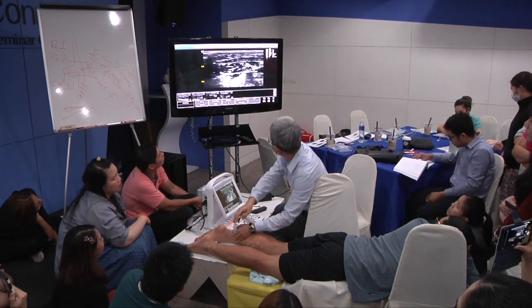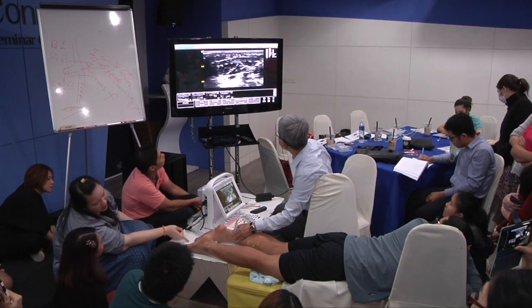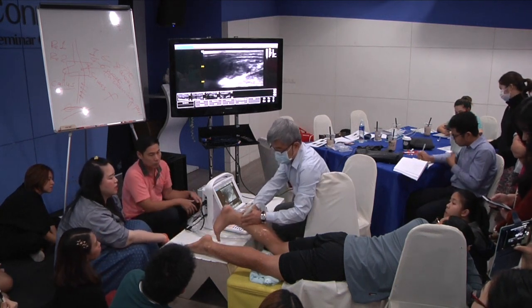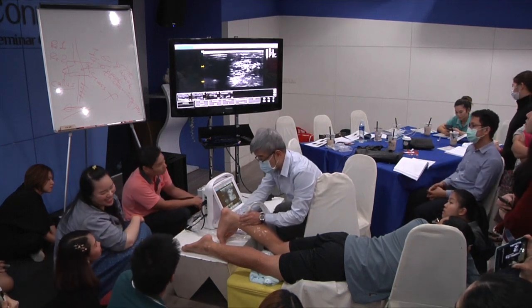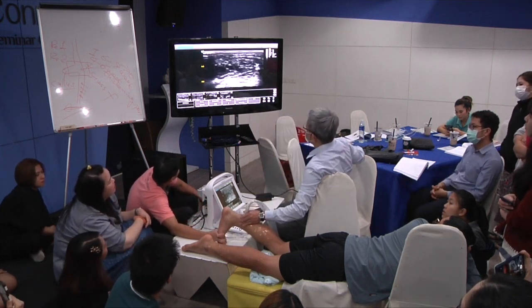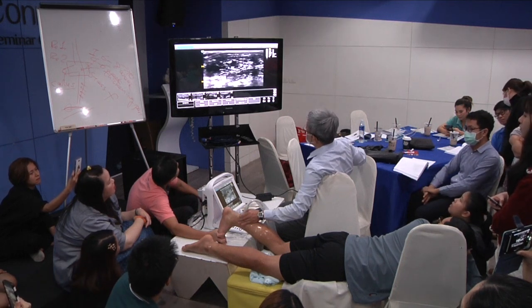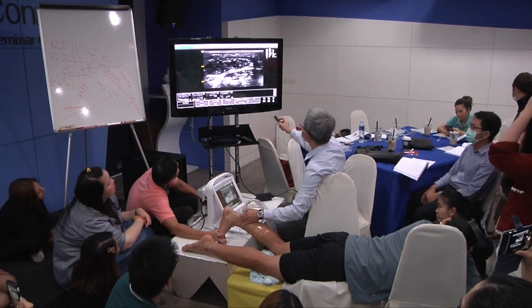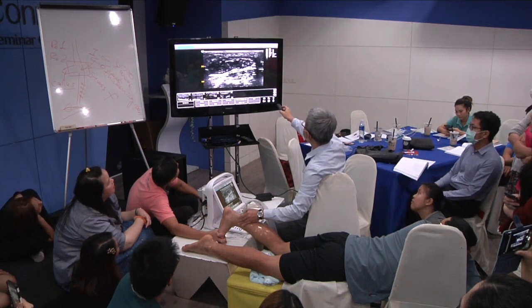It's not a standing position. Okay, basically, right? Okay, so bend your knee. Dorsiflexion is very important. Can you fix her? Dorsiflexion is very important to see the Achilles tendon. Right. This is very bright, right?